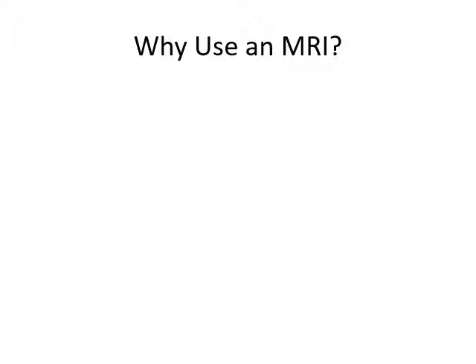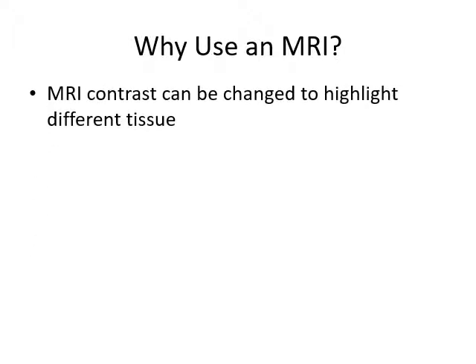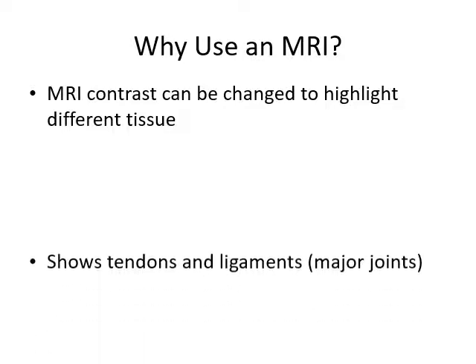So why would you use an MRI? Now remember with both of them, the great thing about them is you can get different images or different directions without having to move the patient. So that's a huge benefit, all right? But basically for the MRI, you can change the contrast to highlight different tissue.